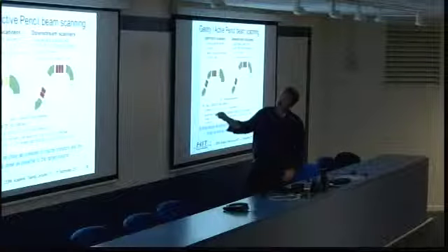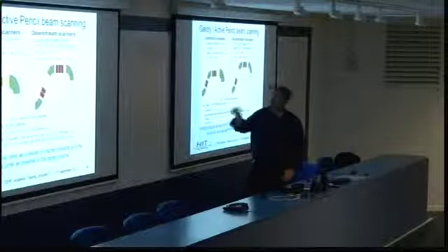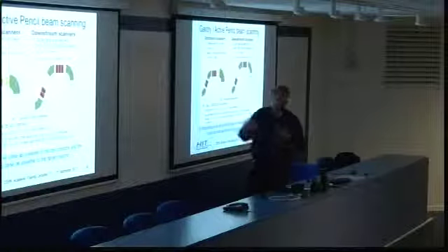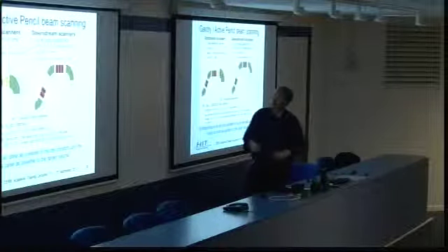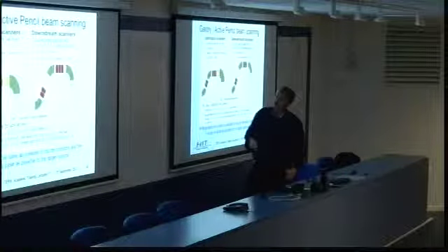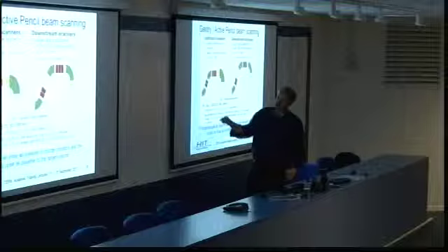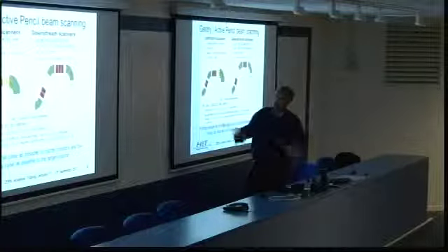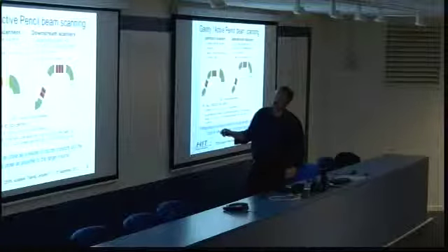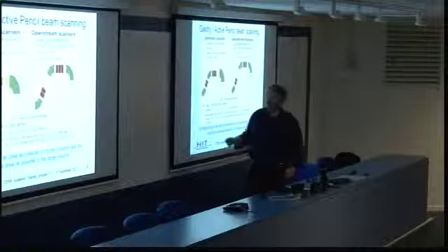But okay, this brings a larger diameter of the gantry. You need a larger room. This goes into the costs and so on. If you do an upstream scanner, then you need a large diameter of the last dipole, and this makes it very heavy. And this goes also into cost.